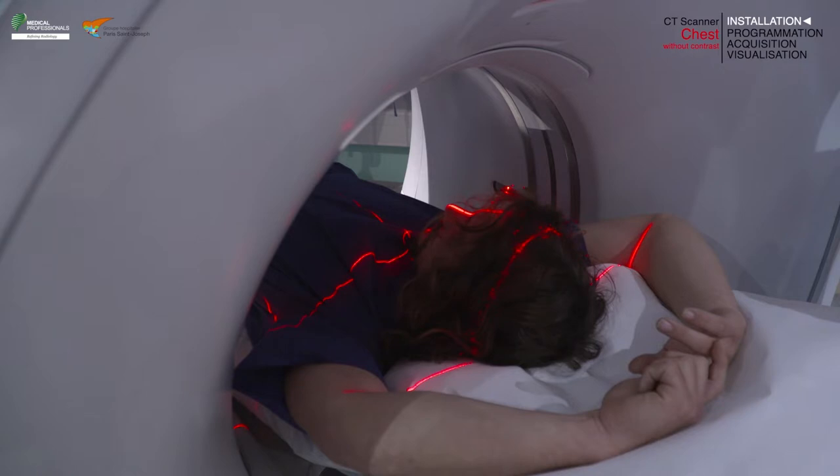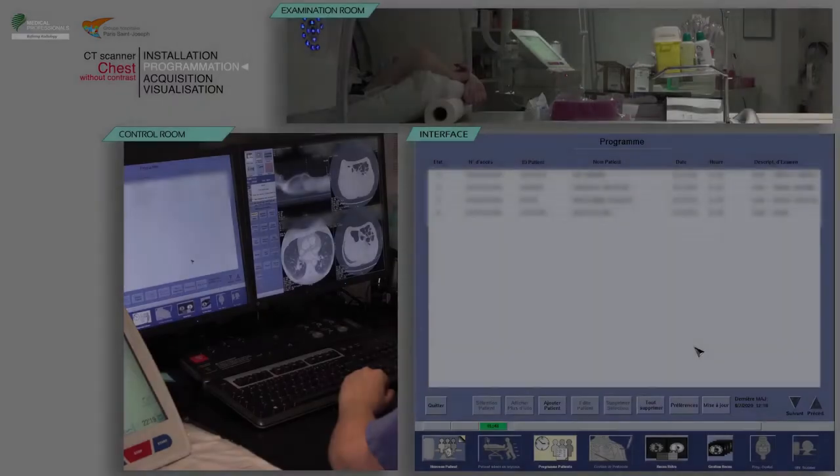Remember to close the doors of the examination room in accordance with radiation protection rules and perform proper hand hygiene.